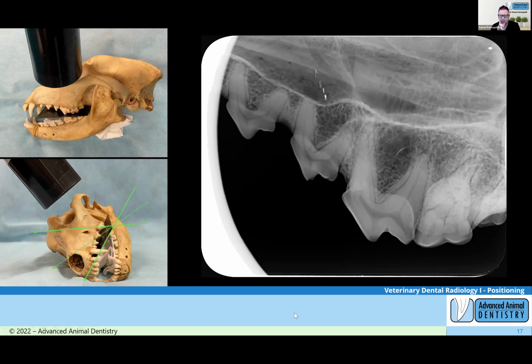On that point too, Beck, I think this is taking a couple of steps back and talking overall about radiology and specifically about digital radiology. We've potentially, and this is my point of view, gotten a little lazy with digital radiology because with our software, we can manipulate these things. It is actually still really important that the exposures that you take are good exposures. Don't just crank it out and blast away. You should be adjusting exposure lengths for tissue thicknesses.